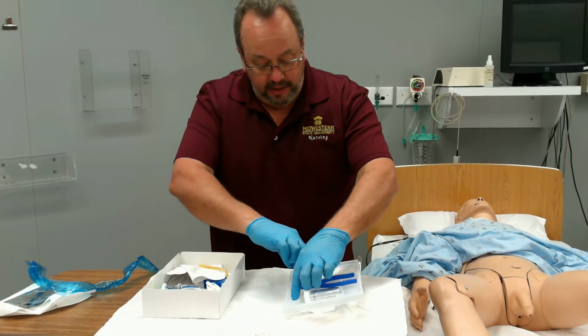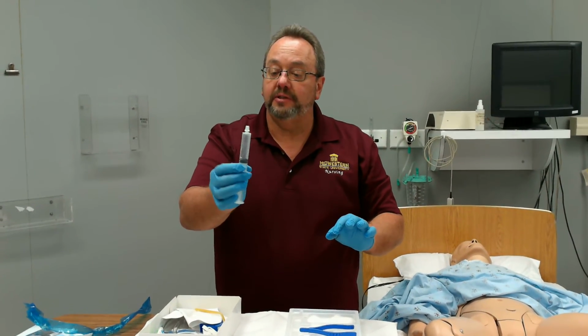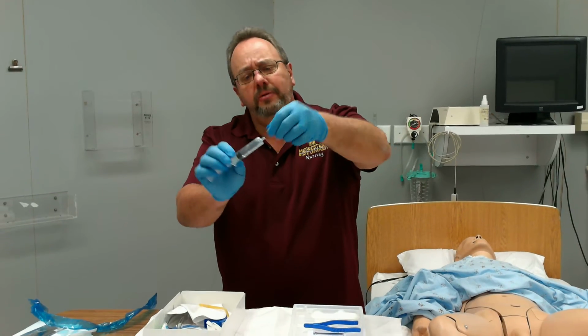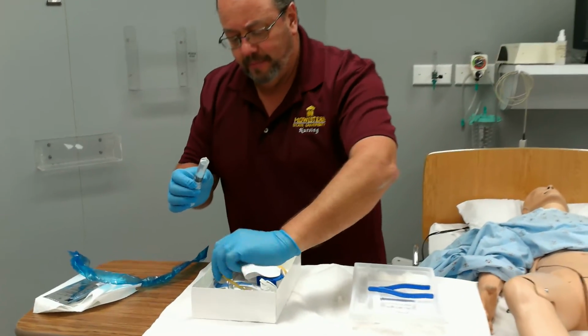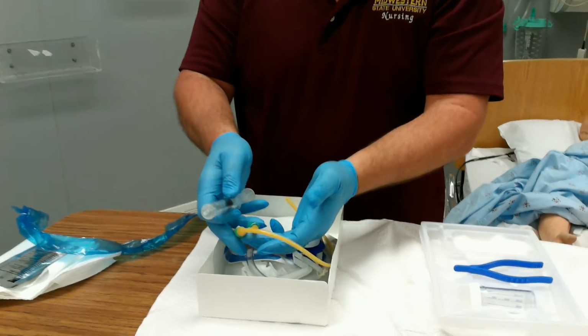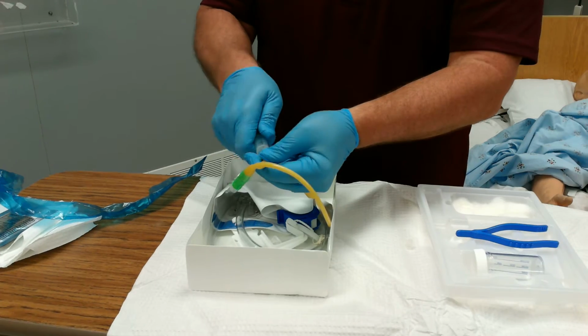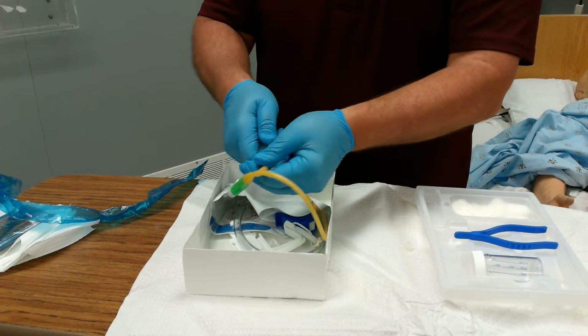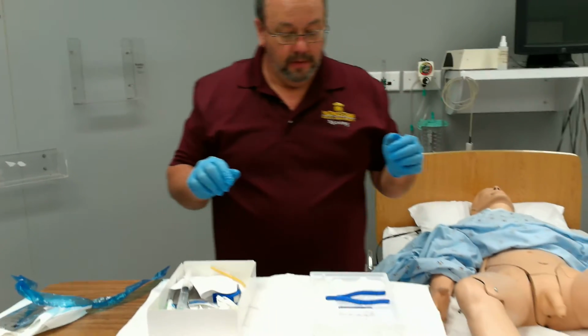I'm going to also now take my sterile water, or sterile water in the syringe, remove the cap, and place it right here on this valve at the bifurcation. And you push that in and make sure it's good and snug. And then just put all that back into the box.